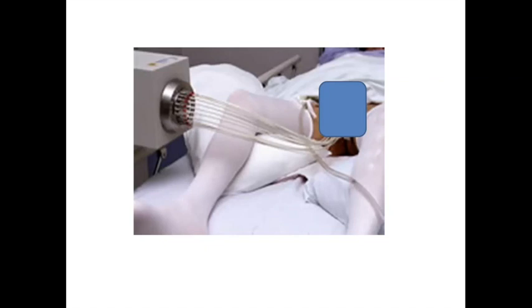The urinary catheter is still in place, and at that point, when the plastic tubes are out of the prostate, we can see whether we've caused much in the way of bleeding into the bladder. And the urine will change colour, and depending on whether it goes a light rosé or a dark claret or remains urine coloured, that dictates to us what we need to do, as in whether we can leave the catheter in for a bit and irrigate the patient. In other words, force some saline into the bladder to wash out any blood or clots, or whether in fact we can take the catheter straight out.